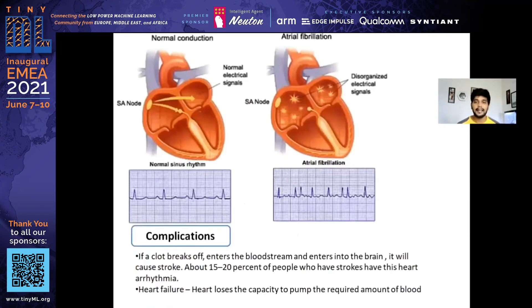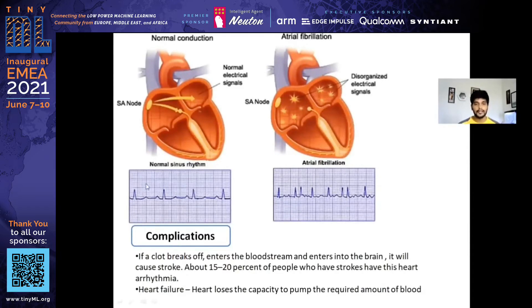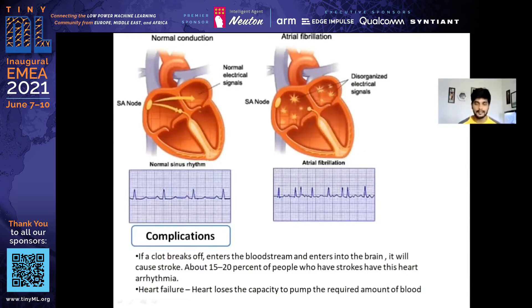Let's look at atrial fibrillation cases. In the normal heart condition, between two R waves the intervals are equally distributed — there won't be much difference. But in atrial fibrillation cases, you can see that some RR intervals will be larger and others will be very small, creating irregular spacing between RR intervals.